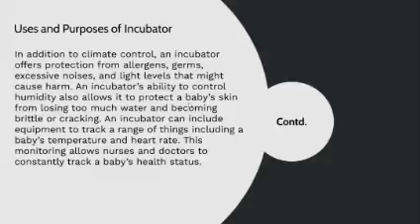There are several uses and purposes of an incubator. In addition to controlling the climate of the baby, an incubator offers protection from allergens and germs by making a biological bubble. It also protects the infant from excessive noises from the outside environment and light levels that might cause harm to the eyes of the baby. An incubator has the ability to control humidity, so it also protects a baby's skin from losing too much water. Skin is the most important organ of our body, so if it becomes brittle or cracks, it can cause and impose many hazards to the life of the infant.